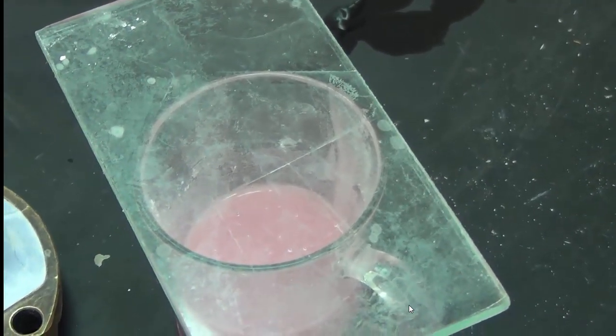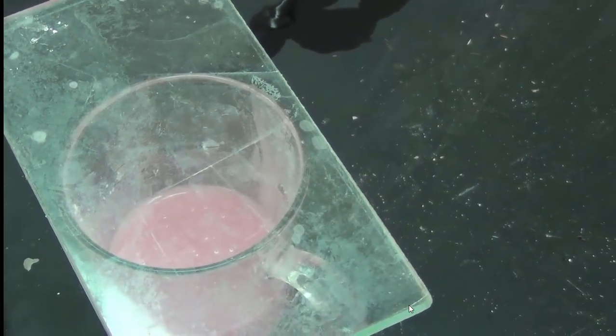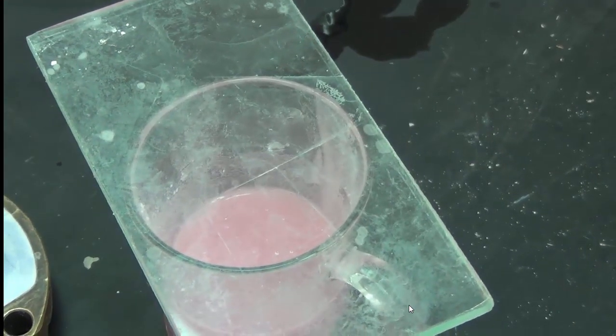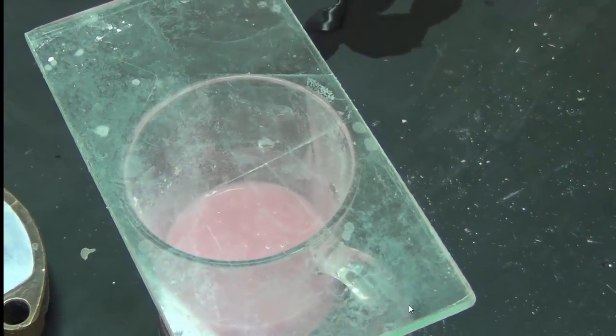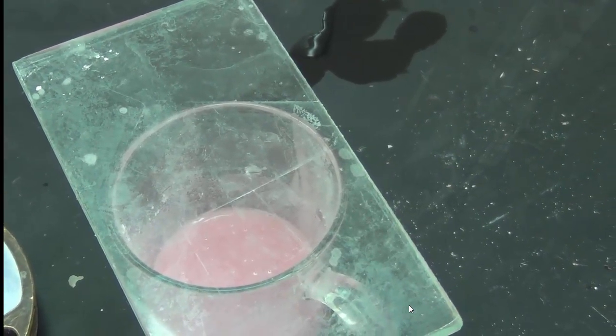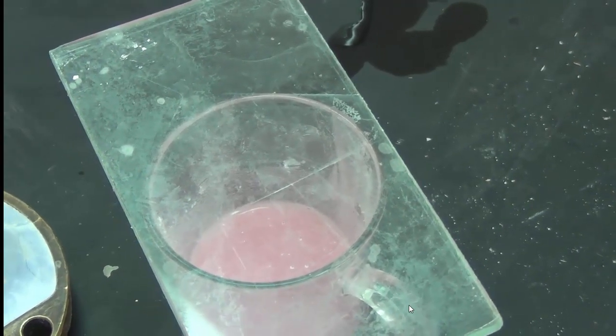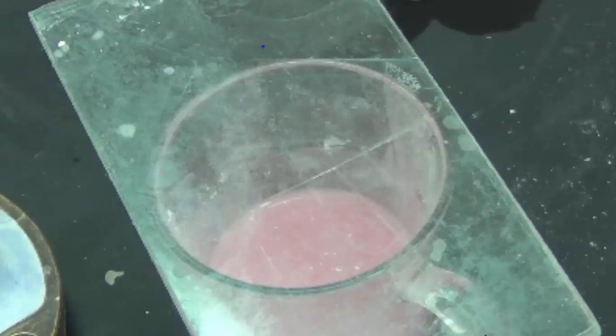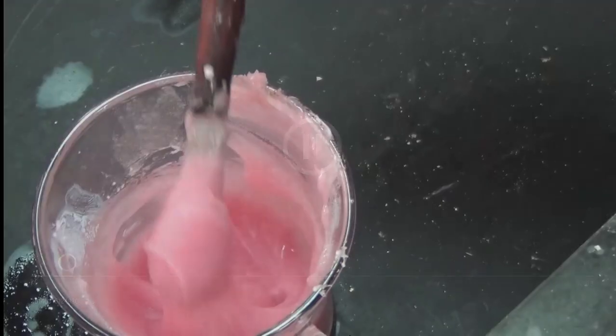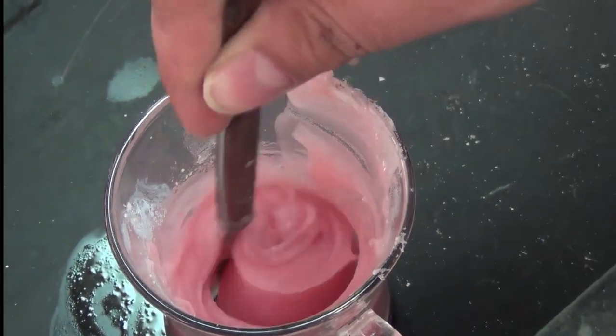The monomer is highly volatile. It evaporates easily, and you can have the smell of the monomer very clear when we are mixing cold cure acrylic. That means this mixture of acryl can lose the monomer, and if it loses such monomer, it is no longer soaked and it doesn't have the glassy appearance. It will become granular. This granular porosity is caused by the loss of monomer during the mixing stage. In all setting times or working times, we should follow the manufacturer instructions. So the time we wait for this mix to reach the dough stage, it's preferable that you follow the instructions from the leaflet accompanying this material. I recheck my material. Now we could still see that it's in the stringy stage, so we have to wait a bit more.